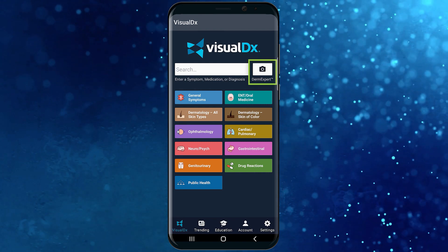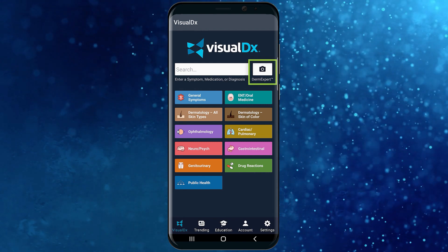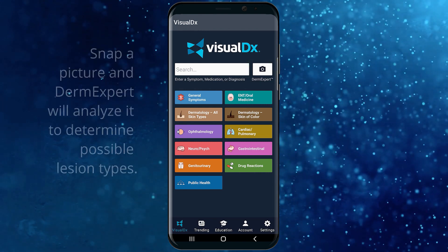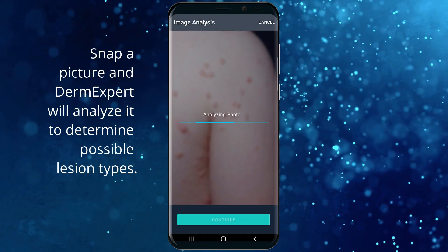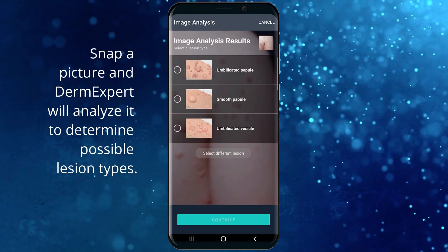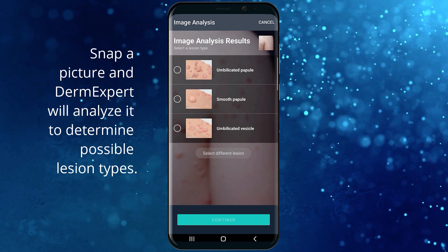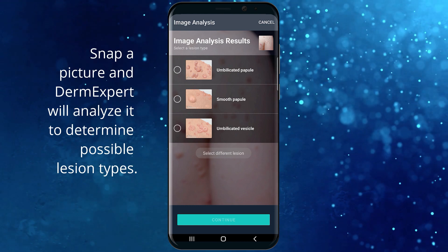To get started, select the camera button next to the search bar on the home page. DermExpert analyzes the photo and, using its sophisticated machine learning, offers three possible lesion types.